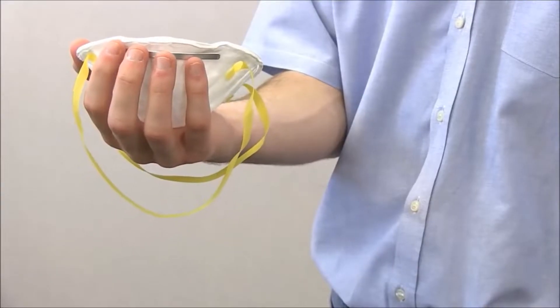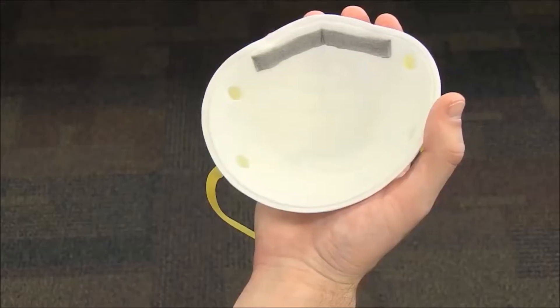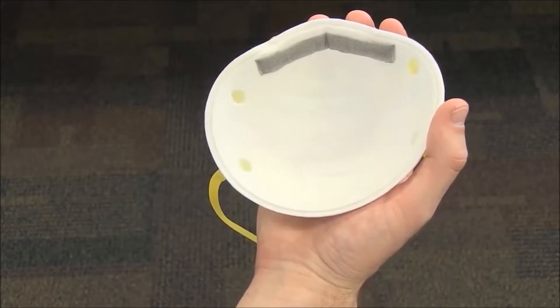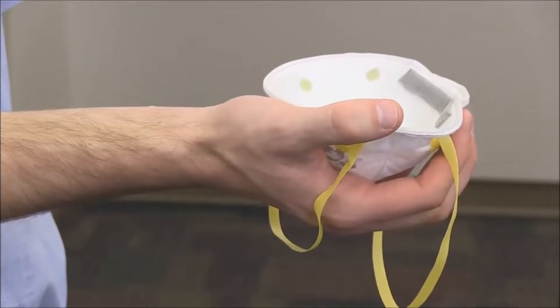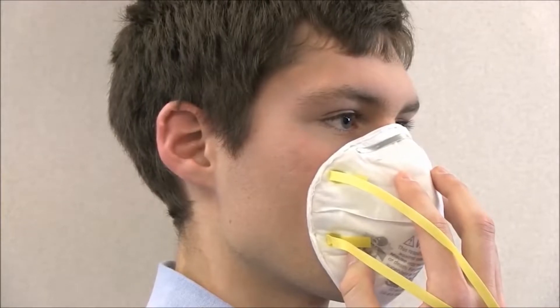To make sure the respirator will fit properly when you put it on, first cup it in your hand holding the metal nose piece in your fingertips. Allow the straps to hang down freely. Position the respirator on your face so that the nose piece meets the bridge of your nose and the bottom covers your chin.